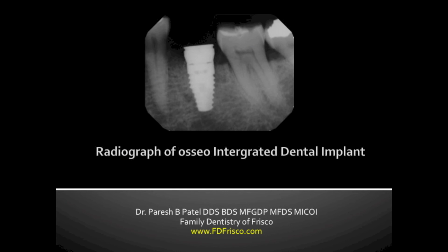Here is an x-ray or a radiograph of the implant fully integrated, and what I mean by that is that the patient's bone has stuck, or rather fused, to the implant, and now that implant is wholly a part of the patient's jawbone. And this is the remarkable nature of dental implants, which has allowed them to be a viable and predictable option for replacement of missing teeth. Once we take the impression, we send this impression to the laboratory and we can get a crown made.